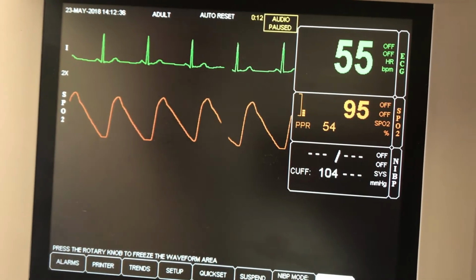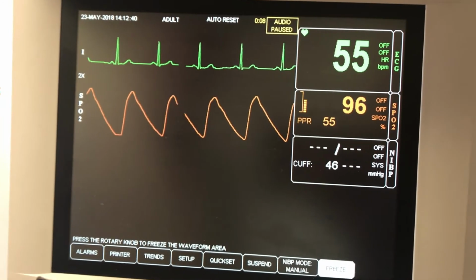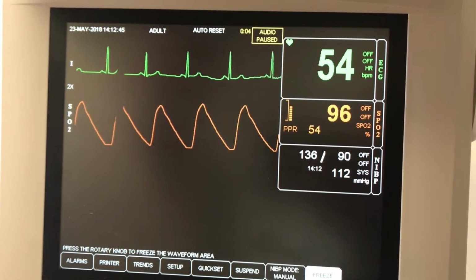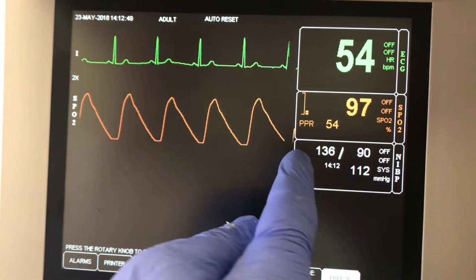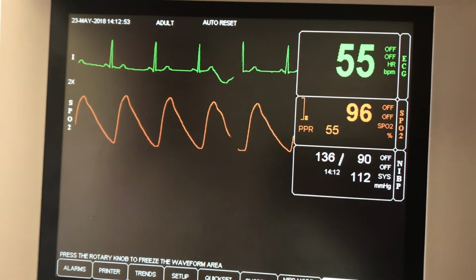Right now it's searching for blood pressure, so we'll see what happens after it quits squeezing the arm. It's not a really true thing, but it's all right. It's 136/90. He does take blood pressure medication, and now the air is out of the cuff. His pulse ox looks pretty good, and so what I'm going to do is print it.